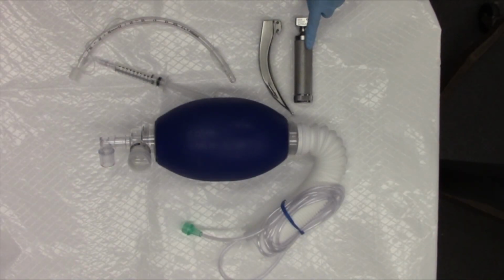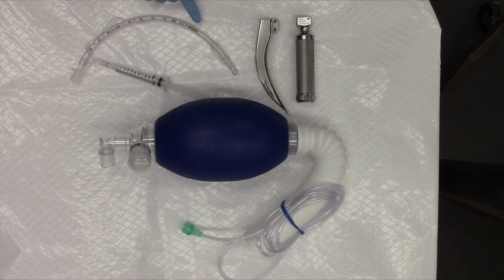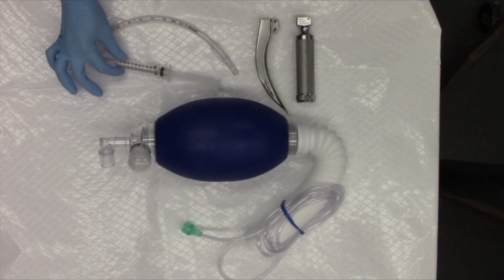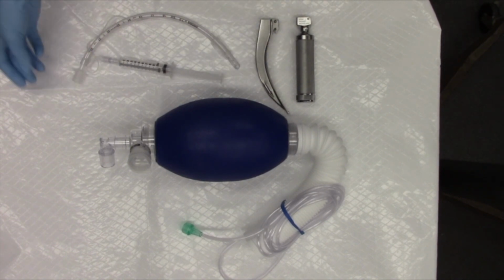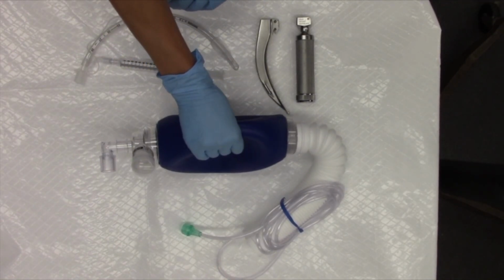We're going to be using a MAC 4 blade. Here's the blade, here's the handle. We'll be inserting an endotracheal tube, a 7.5. Once the tube is in the right position, we'll inflate the cuff right here with a 10 cc syringe. Then we'll attach the ambu bag, this part, to right here, and we'll use this to inflate the lungs.